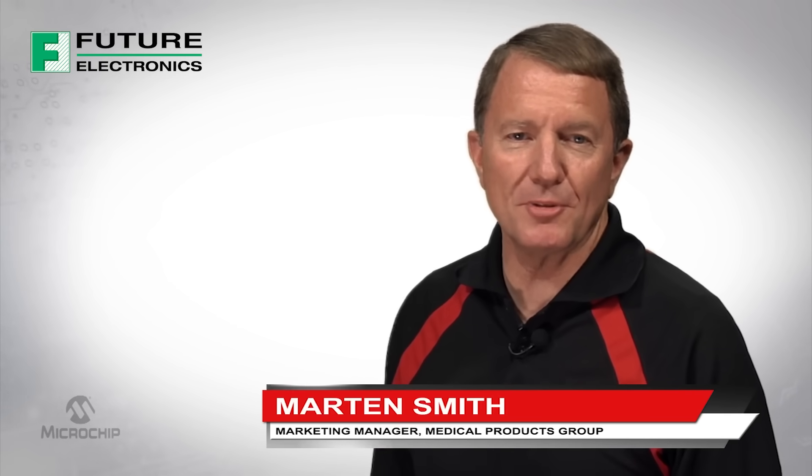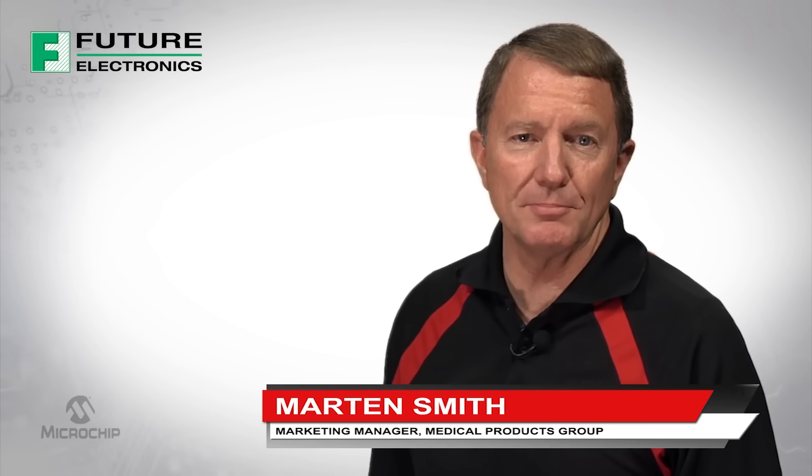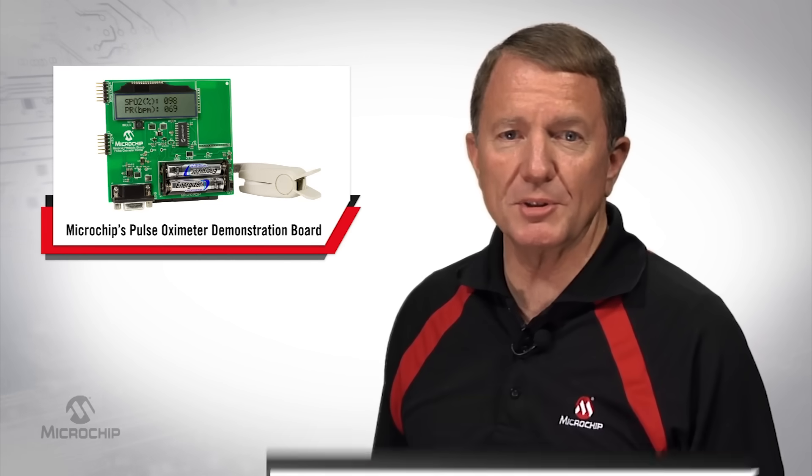Hi, I'm Martin Smith, Marketing Manager for Microchip Technologies Medical Products Group. I'd like to show you Microchip's Pulse Oximeter Demonstration Board.